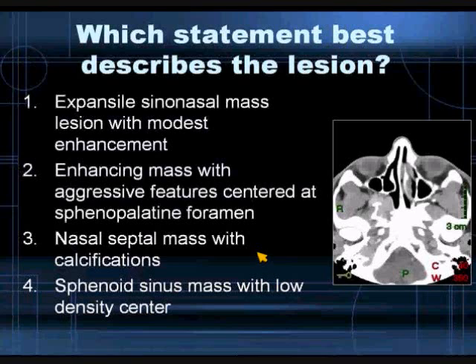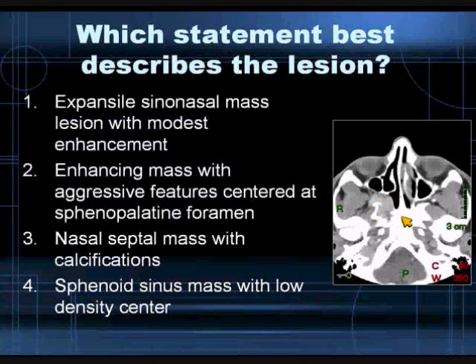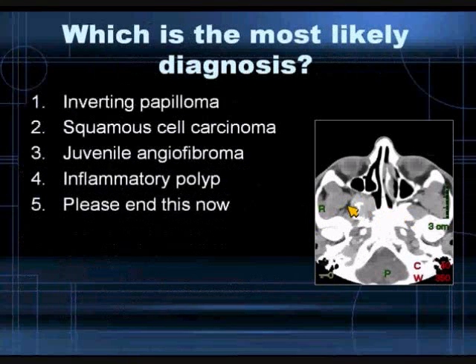88% of you feel that this is an enhancing mass with aggressive features centered at the sphenopalatine foramen. Here's the pterygopalatine fossa, and at its aperture into the nasal cavity we find the sphenopalatine foramen. This lesion is centered at that location, widening and expanding into the pterygopalatine fossa, actually into the nasopharyngeal masticator space, and secondarily involving the sphenoid bone with destructive changes.